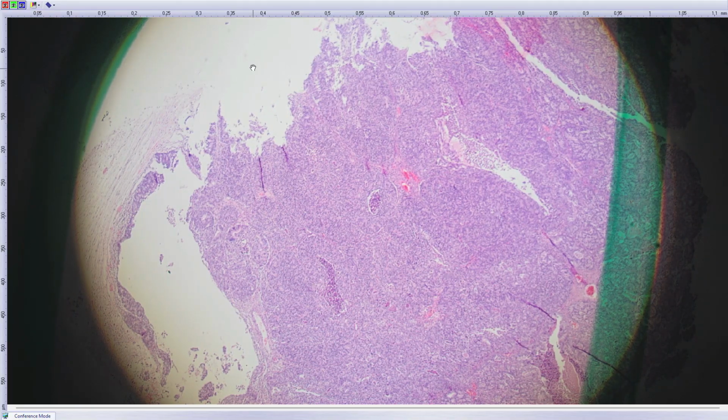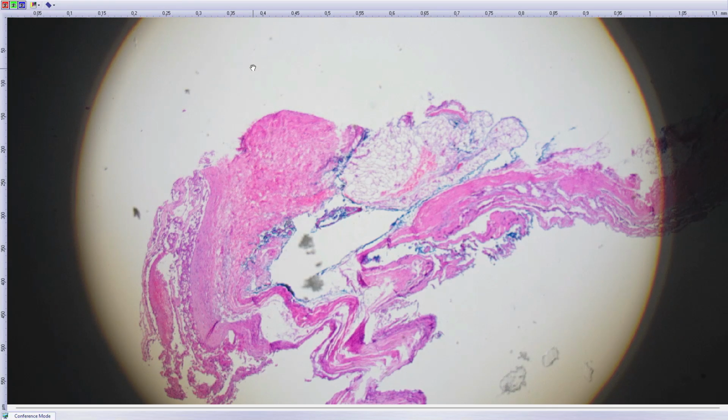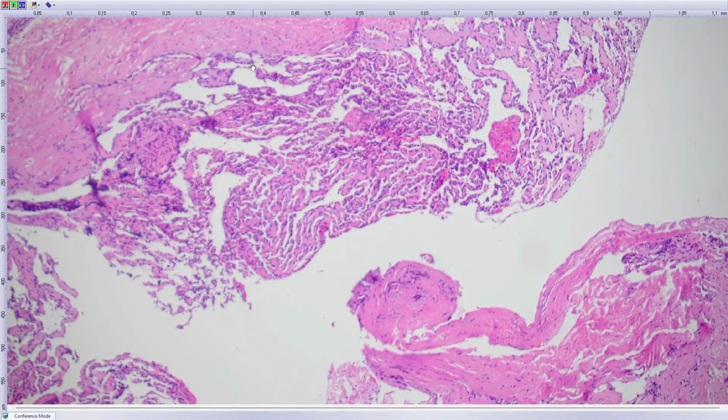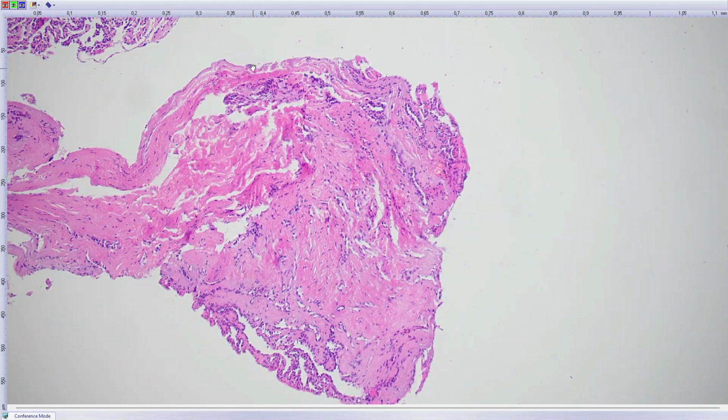Okay, I have just a few cases, two or three cases. Michael Jr. speaking. This next case is a 32-year-old male with a tumor on his chest, somewhere in the midline. The clinical diagnosis was a cyst. So clinically, it was thought to be a cyst, and the submitting pathologist sent it with a diagnosis of a vascular neoplasm of unknown potential, and this is what we had.